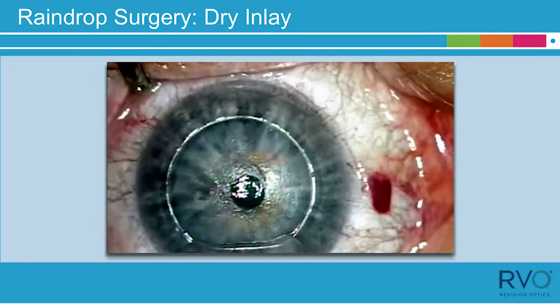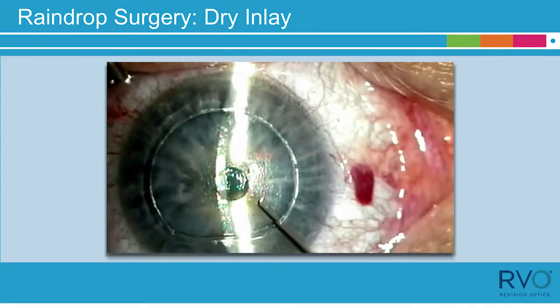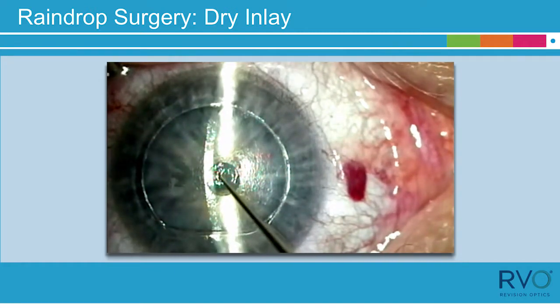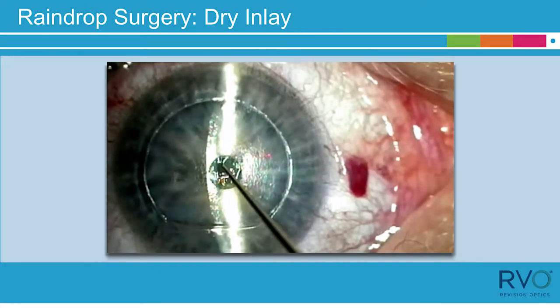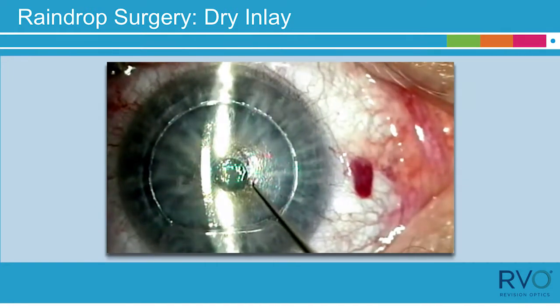Visually inspect the raindrop near-vision inlay for damage. In order to get the inlay attached to the stromal bed, allow it to dry by letting it rest on the stromal bed for approximately 60 seconds without manipulation.